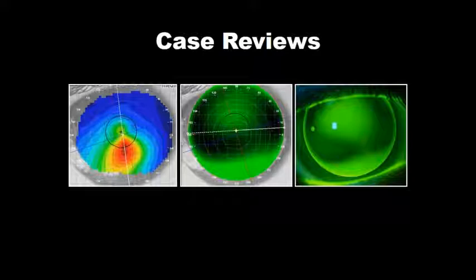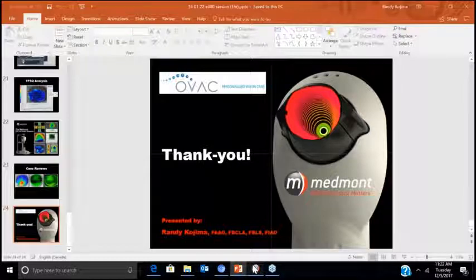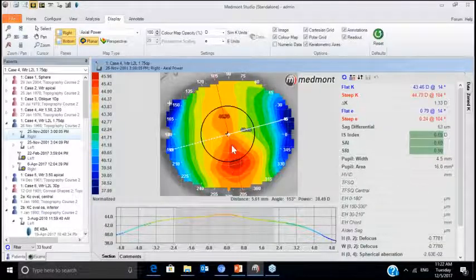And the Medmont is the only placido-based topographer that will give us 100% of the cornea, which can then be converted to elevation. Once we understand the height of the eye, then we can drop a corneal GP on, we can drop a scleral on, and that helps us to choose the right first lens. The instrument also has very powerful contact lens software related to orthokeratology, which we're going to discuss in a second. And then, as we said, we can do tear film analysis. So really, it's why the Medmont? It's the Medmont because it is such a powerful tool in specialty contact lens practice.